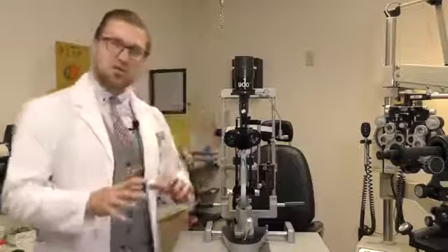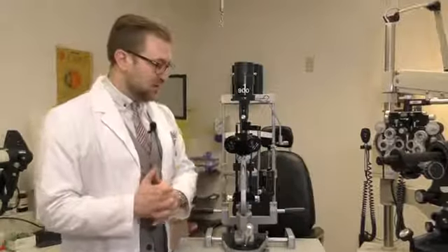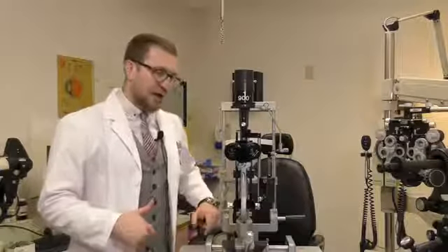Okay, so today we're going to look at the slit lamp biomicroscope, which to me is probably the most useful tool that we have in ophthalmology to look at ocular pathology. Now this is the Haag 900. It's your most commonly used slit lamp that's readily available at most clinics. So basically I'm just going to show you some of the basics and how to make it work for you.